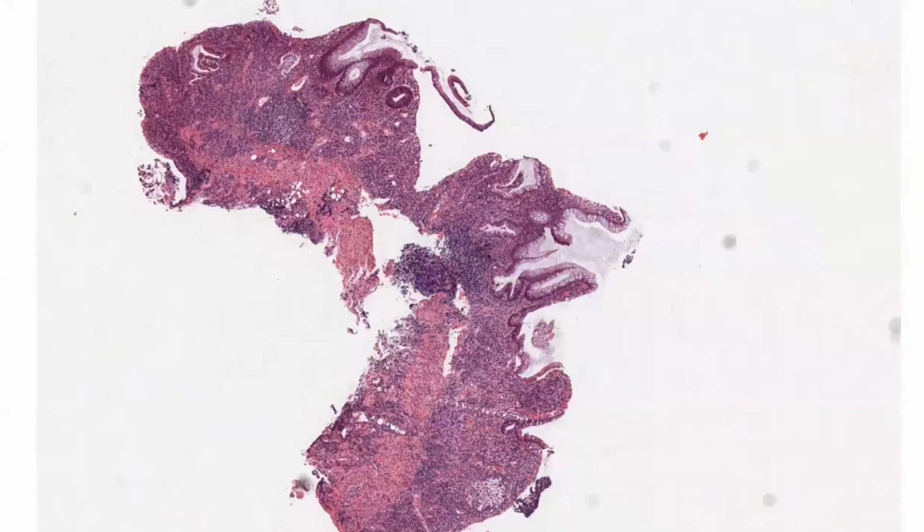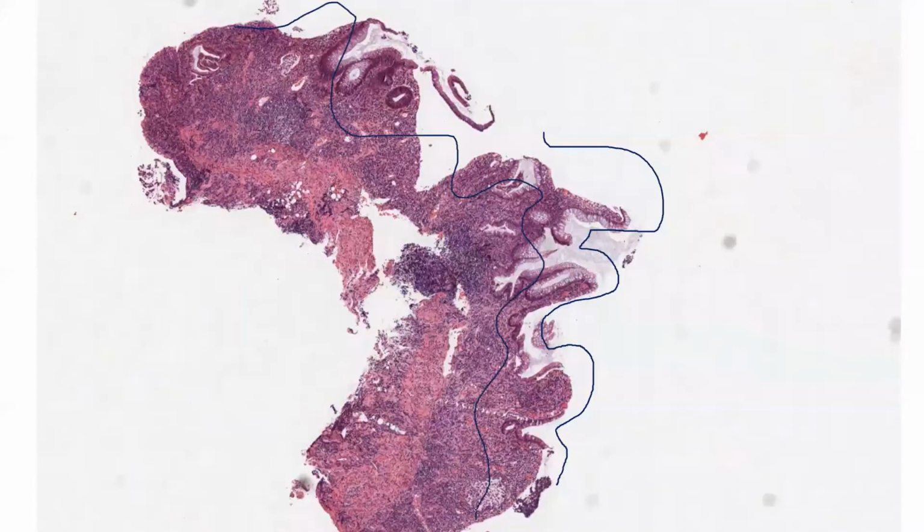You see, the villous surface of the large bowel mucosa is not a normal thing. Okay, it is not normal to have this broad villus, and then you get these little villi and a little bit thin, and the surface is very irregular in general. This is an architectural distortion, okay, and this has to be really looked at.